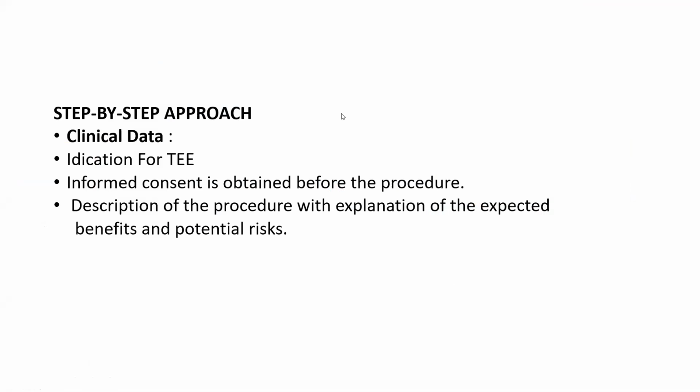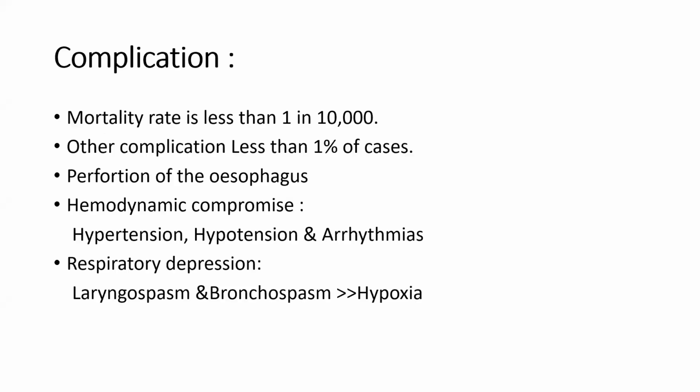Before you proceed for moderate sedation, start to ask the patient about symptoms of, for example, infective endocarditis, and describe to the patient that we will give you some moderate sedation. You will be fully conscious. You can feel everything, and you can communicate with us. Whenever we ask you to swallow, just swallow, and it will go directly to the esophagus. So you explain the procedure to the patient. Of course, you take a consent from the patient.